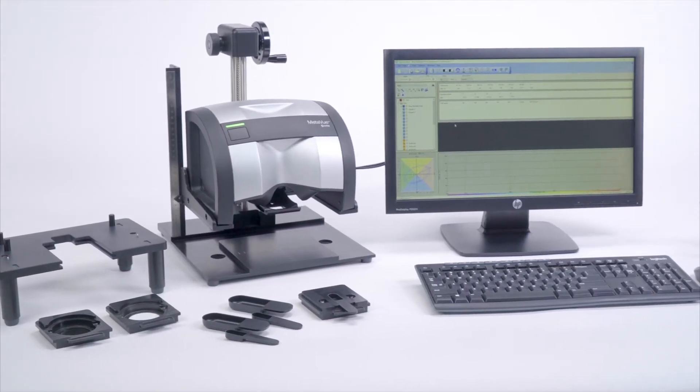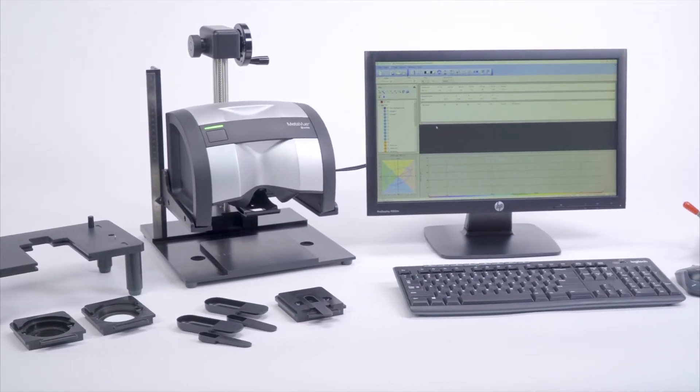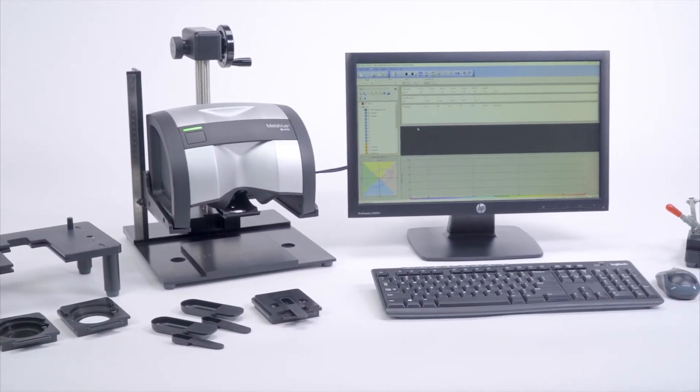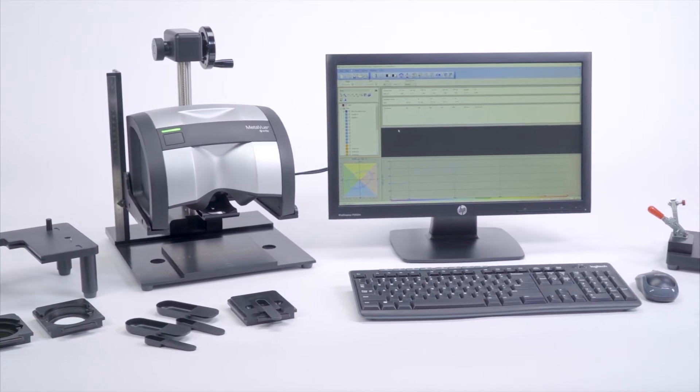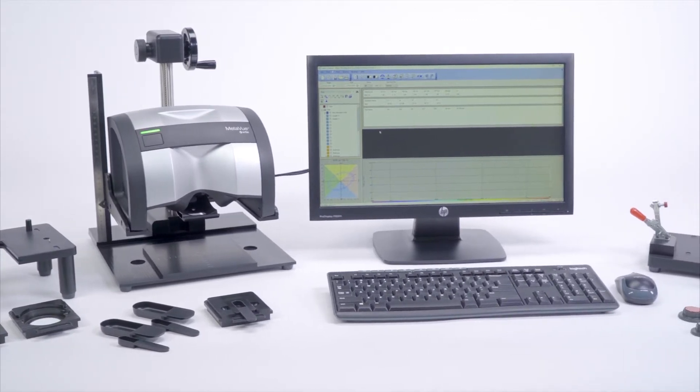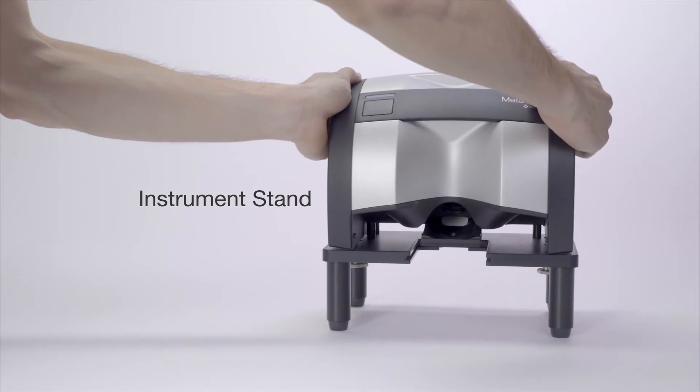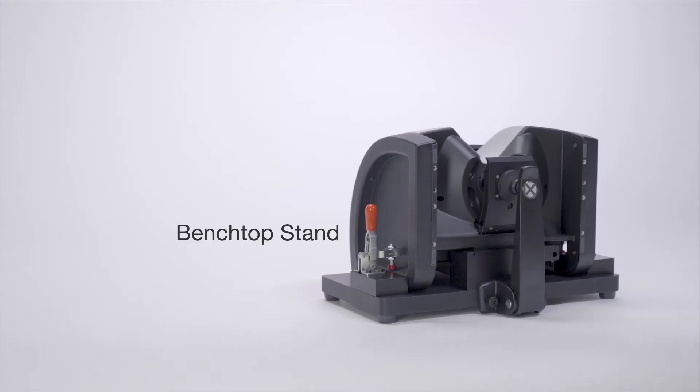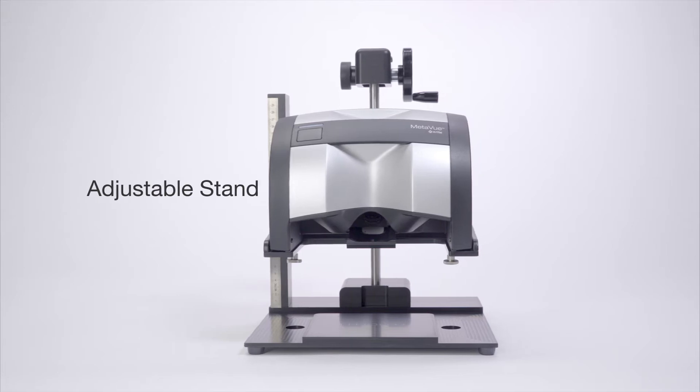And you can always capture the right measurement for the job with one of three customized stands: the instrument stand, benchtop stand, and adjustable stand.